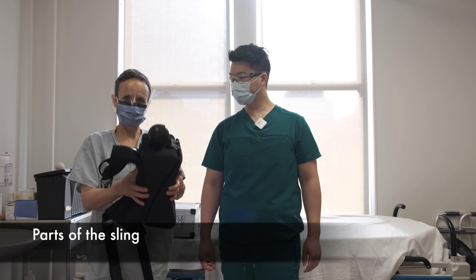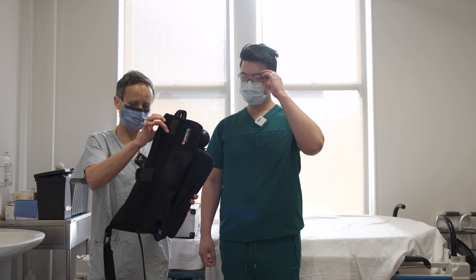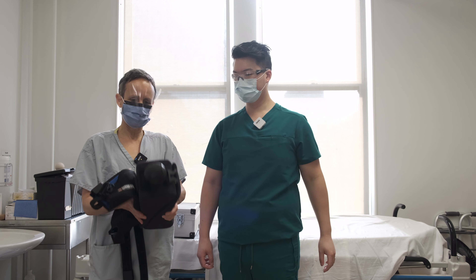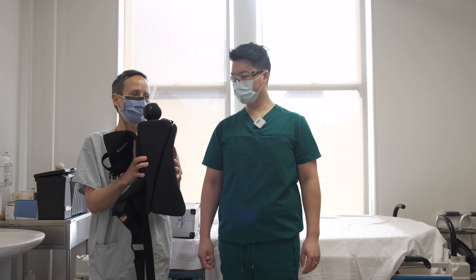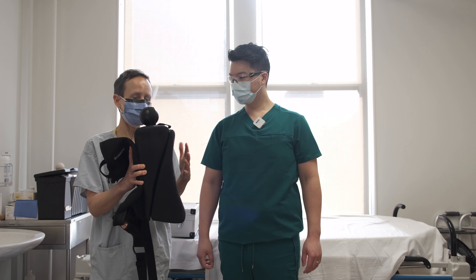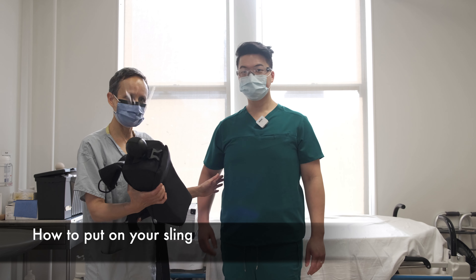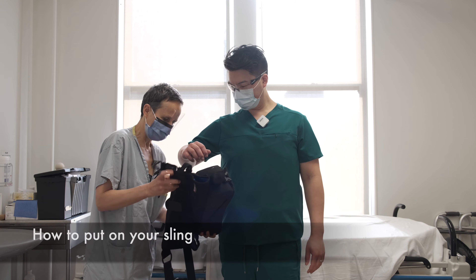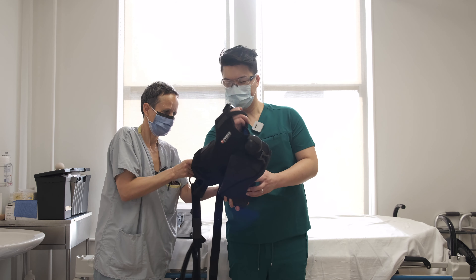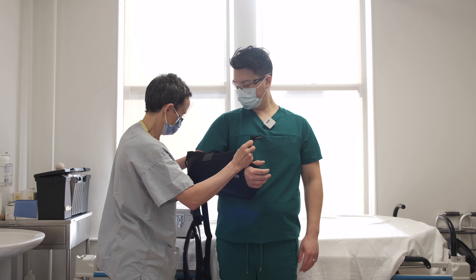We're using this particular sling — it's from Breg and it comes with two parts. One is the sling where the arm rests and gets supported by straps. The other part is two pillows, and depending on the surgery, you use those pillows to get the arm in a good position — they go between your body and your arm. As we put the pillow on, you slide your arm in all the way, and you squeeze those pillows in between your body and the arm.